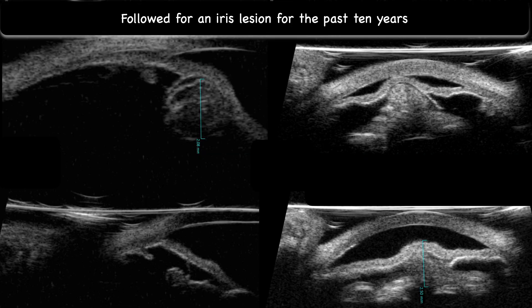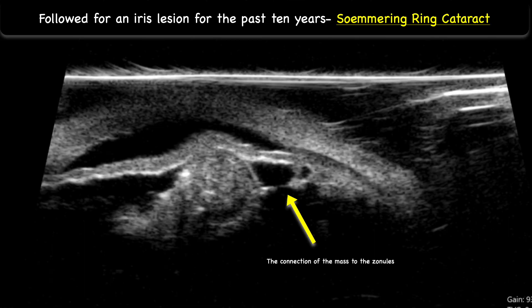She was also followed for an iris lesion for the past 10 years. As seen on ultrasound biomicroscopy, this is a retained Sommering ring cataract. The connection of the mass to the zonules, as depicted by the arrow, and the history of cataract extraction with aphakia are clues that lead to the diagnosis.